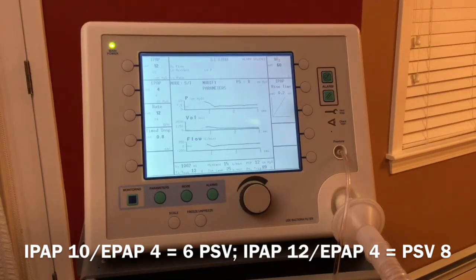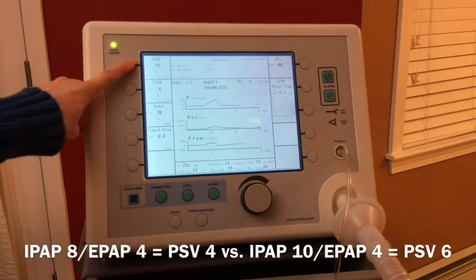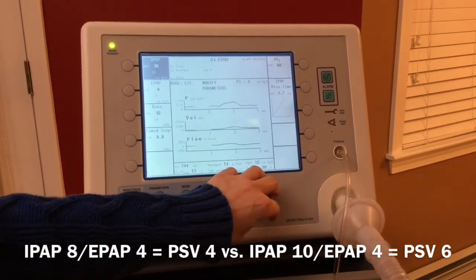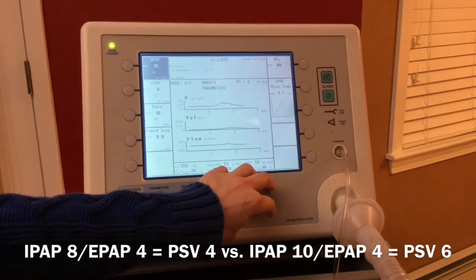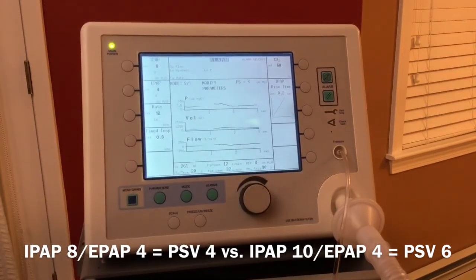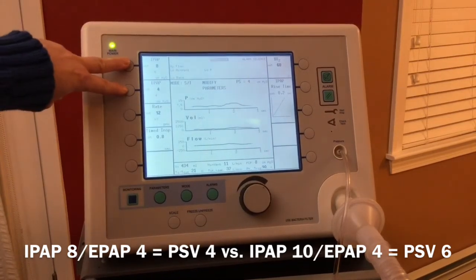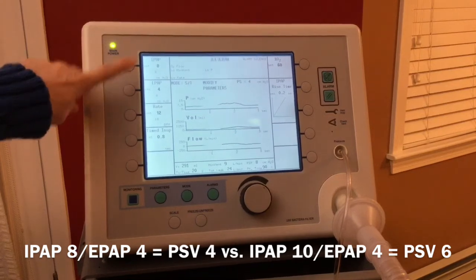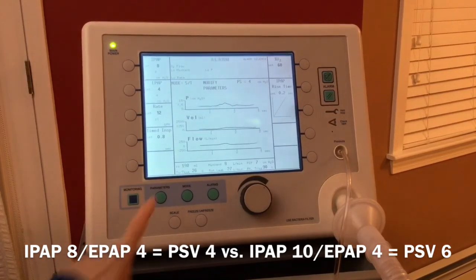Say we wanted to decrease tidal volume. Instead of being on 12 or 10, where at 10 we were getting 600 to 700 milliliters, let's go down to an IPAP of 8 with the EPAP of 4. Now our delta pressure change is only a difference of 4. So the pressure support amount is 4. Now look at our tidal volume sizes here.